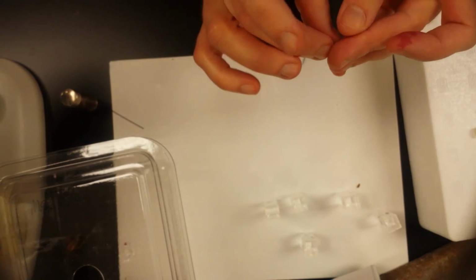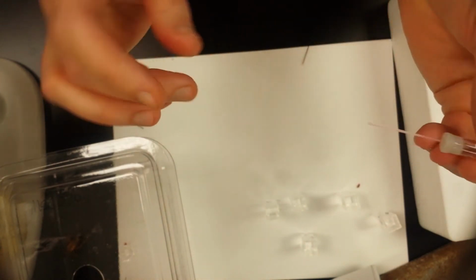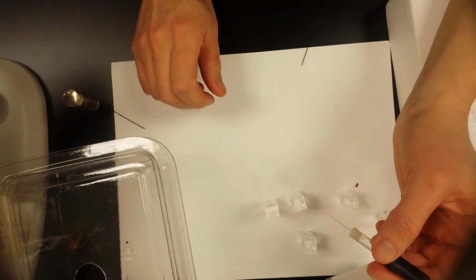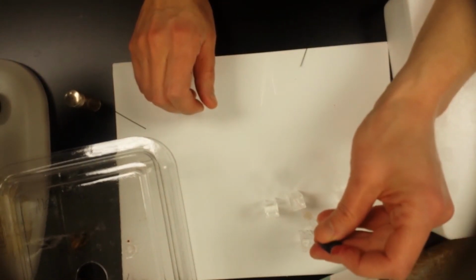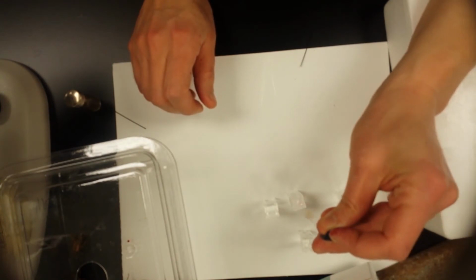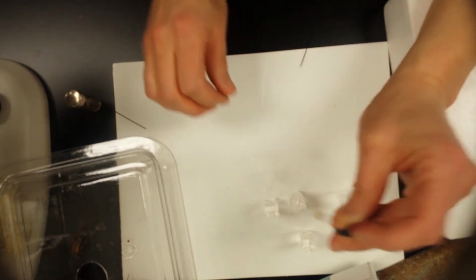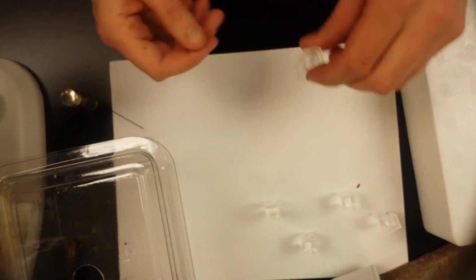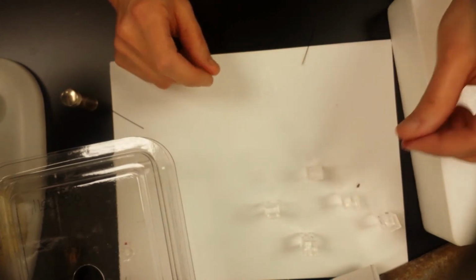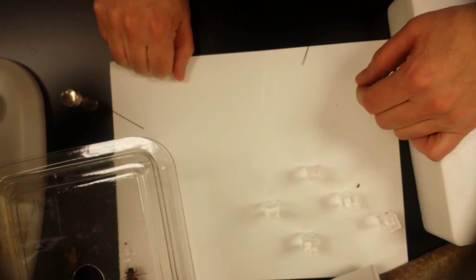Okay, there we go. Put that cricket back. And then I'm going to take this bulb and deposit that hemolymph into a cuvette. Okay. And give that a good mixing. And then we can read the absorbance of that sample in a spectrophotometer.